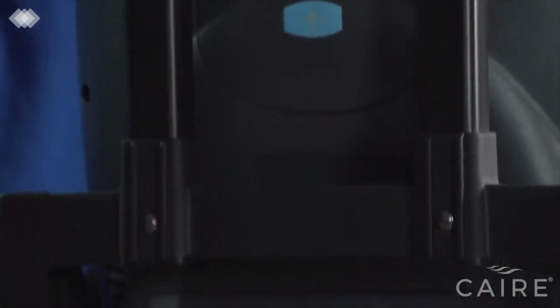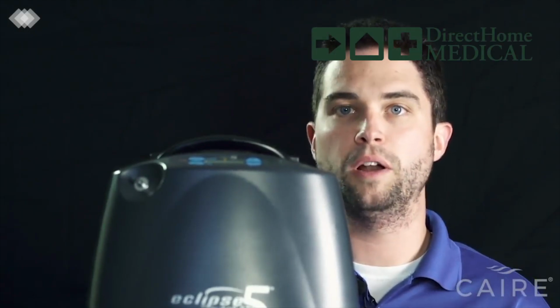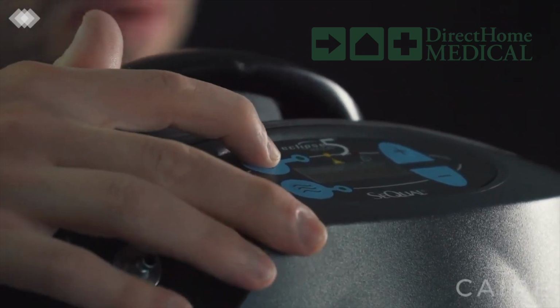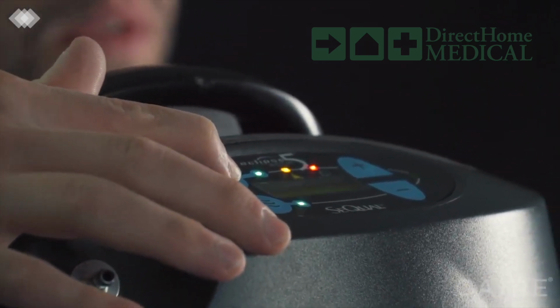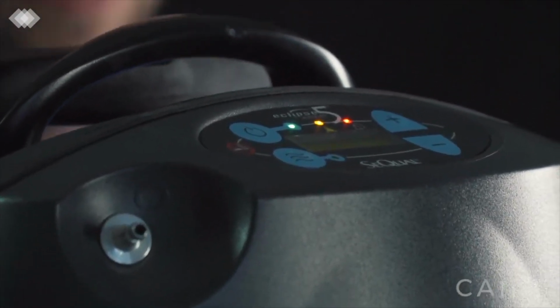The one thing you do want to note is that you can still remove and change the battery cartridge while the Eclipse is on the cart. Now you're ready to begin using your Sequal Eclipse 5 portable oxygen concentrator. To power the unit on, press the top left-hand button, the power button, and hold it down for about 2 to 3 seconds. Once you hear the beep, release it, and you're ready to go.